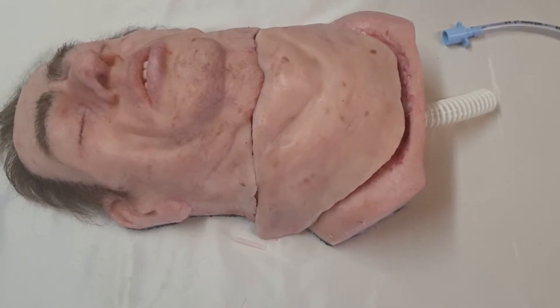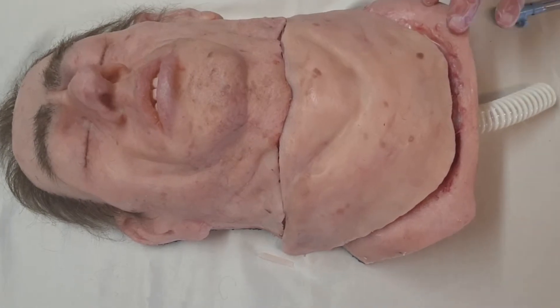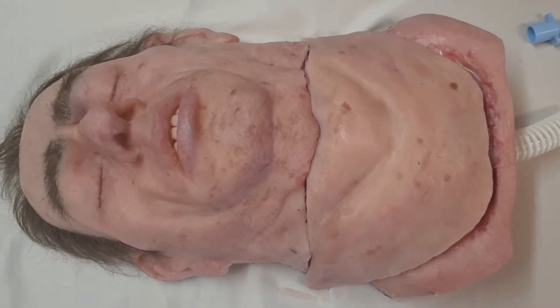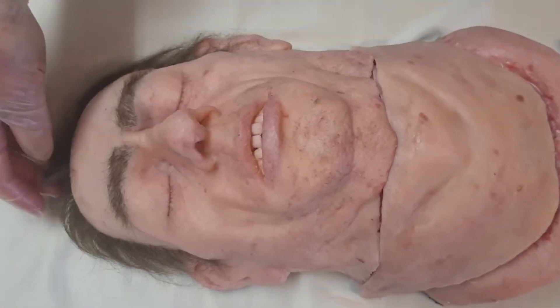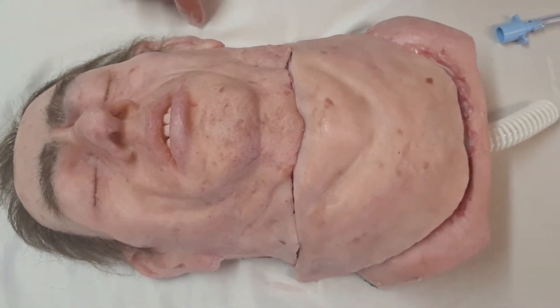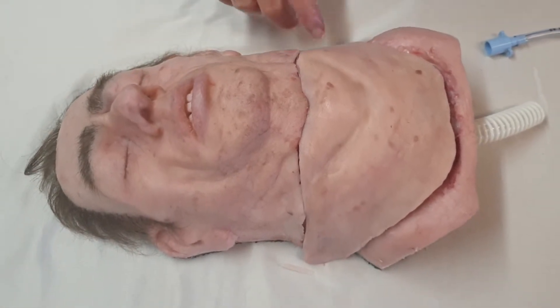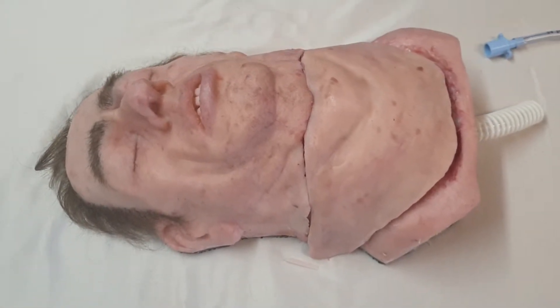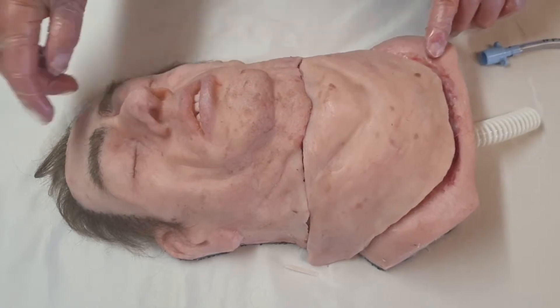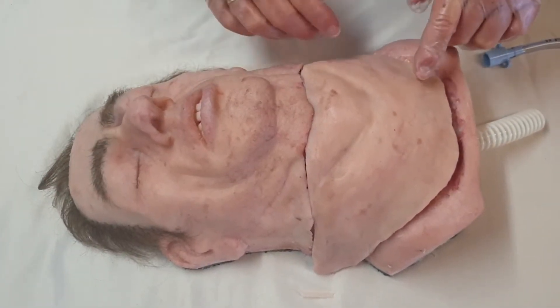In this video I am going to show you how to work with Big Clint, our fat neck model. Big Clint is developed with anesthetists here in New Zealand, and there was a requirement for access to a fat neck person. You can see here that Big Clint has got a normal face and a separate neck.